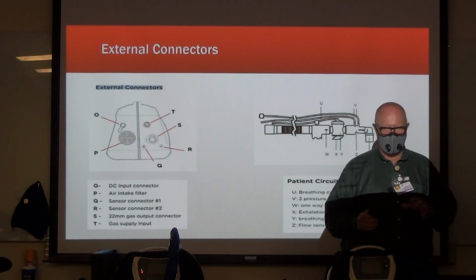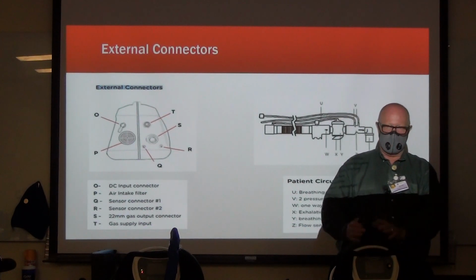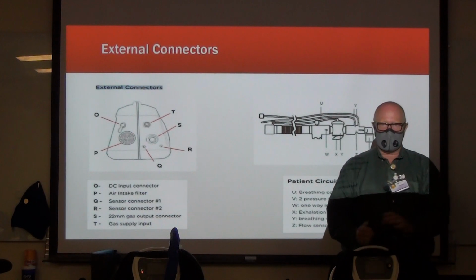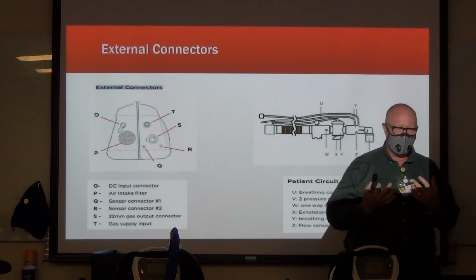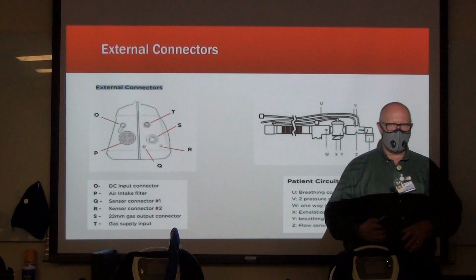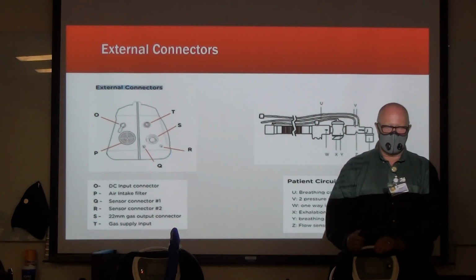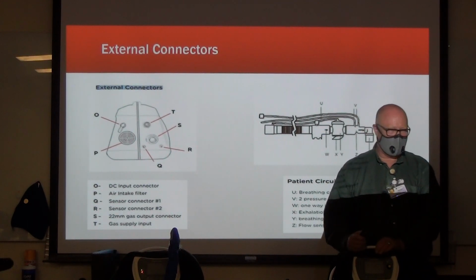Then you're going to see how your patient does. And I heard this being said the other day, it doesn't matter this vent or any other vent that's out there, you're going to have some variances in how the patient's receiving that pressure, and it might be a little bit discomforting or not enough, and you might have to make some adjustments. So 10, 15, sometimes 20 minutes might be necessary whenever you're doing that.